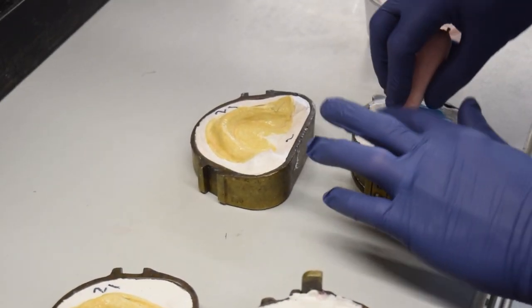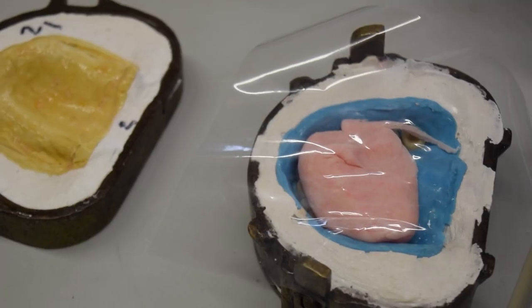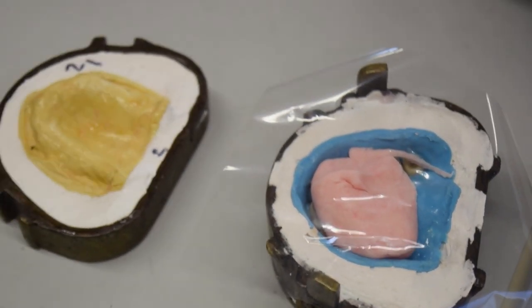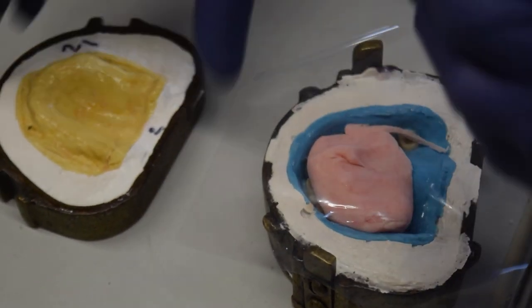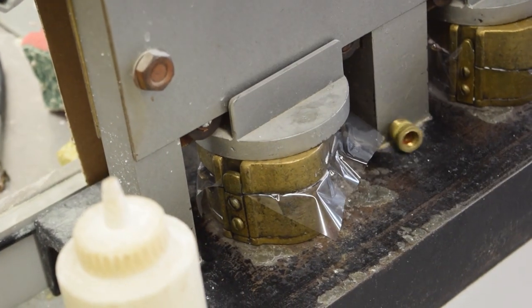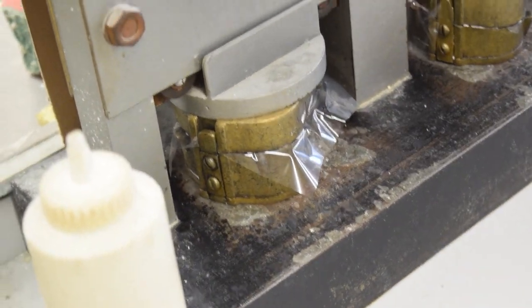We offer three manufacturing methods for full dentures at Utica Dental Lab. Traditional dentures are made with a 4-5 step process where a number of models and impressions are used before the final prosthesis is made with Lusitone 199 acrylic via the press pack method.